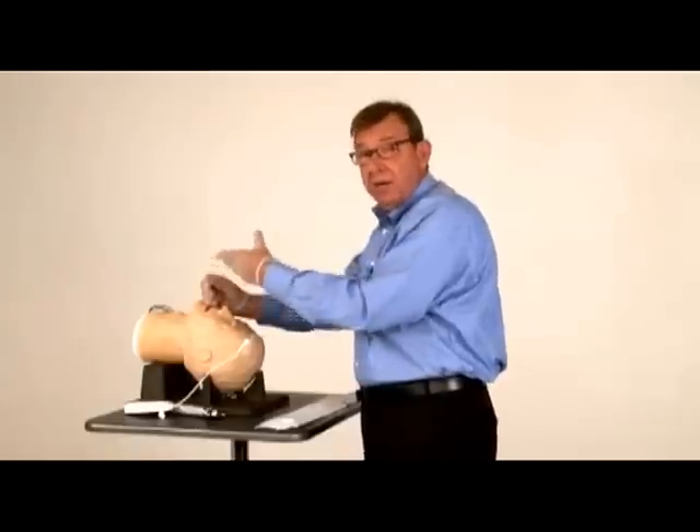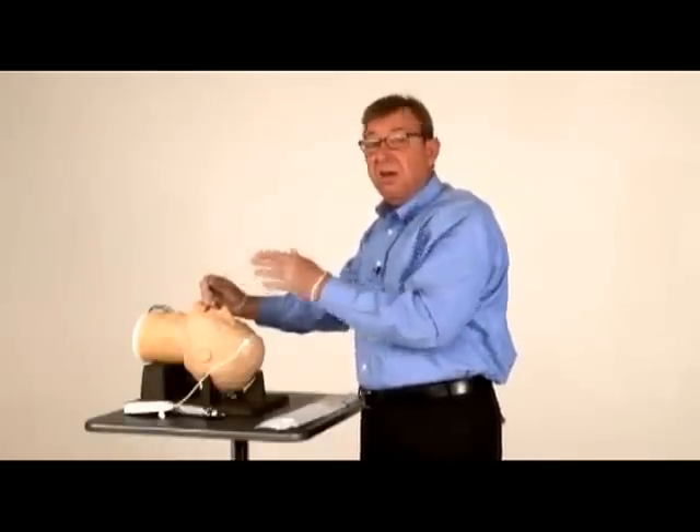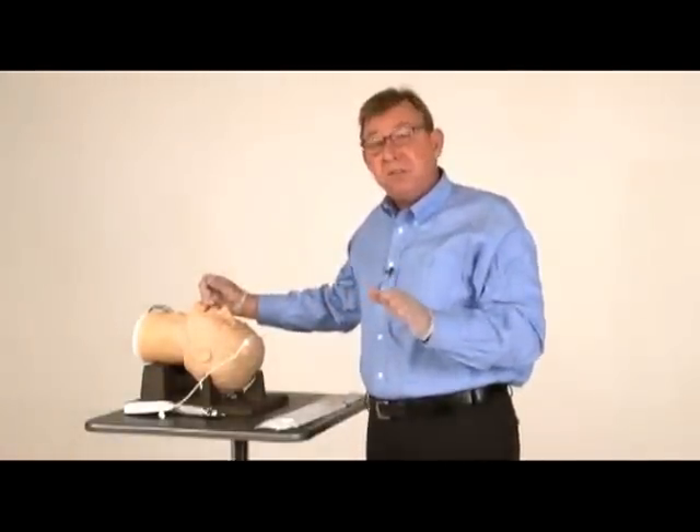Hold firmly onto the top of the ET tube connector so you neither lose your position nor your connector. Then, of course, check it with your bag, auscultating both lung fields. And that's how simple and easy the ViewStick is to use.